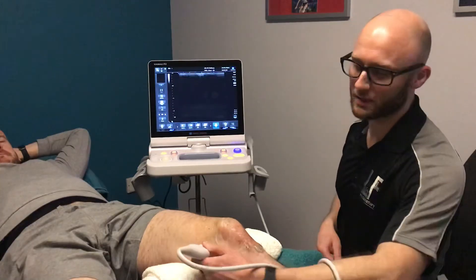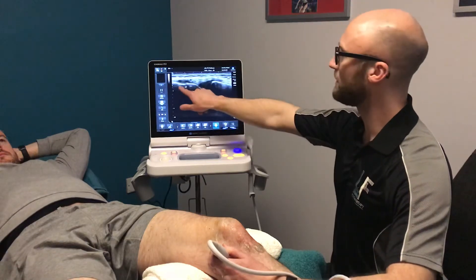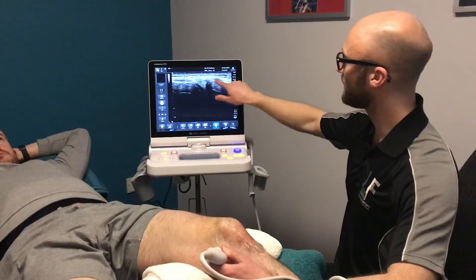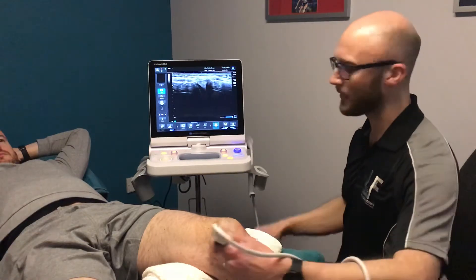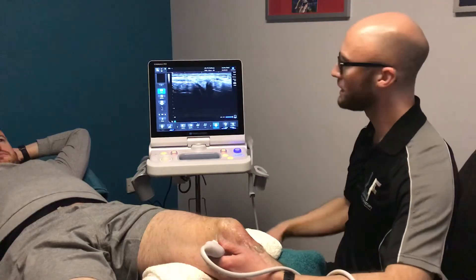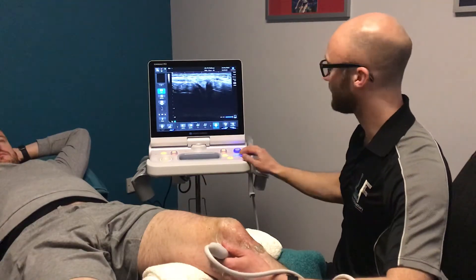Coming down the inside of the knee further, we can actually look at the knee joint line. Here we have the femur, the thigh bone, connecting and articulating with the tibia, the shin bone, and in the middle there we have quite a nice image of the meniscus which is a specialized cartilage in the knee. Overlying the meniscus we've got the medial collateral ligament, so any MCL injuries, sprains, or tears can be picked up with ultrasound quite nicely.